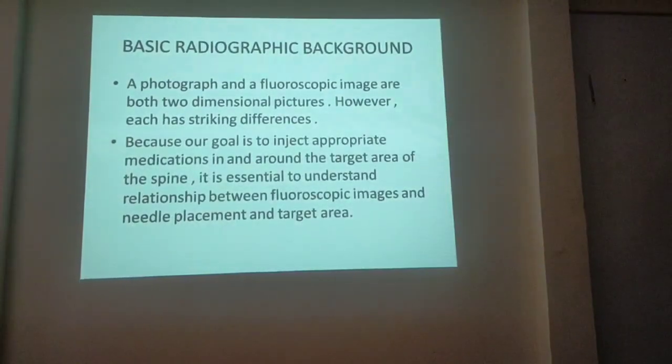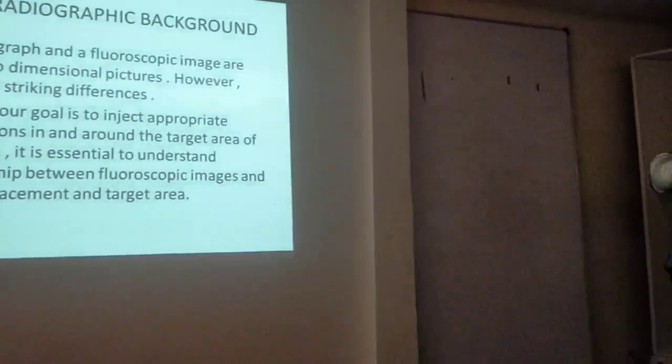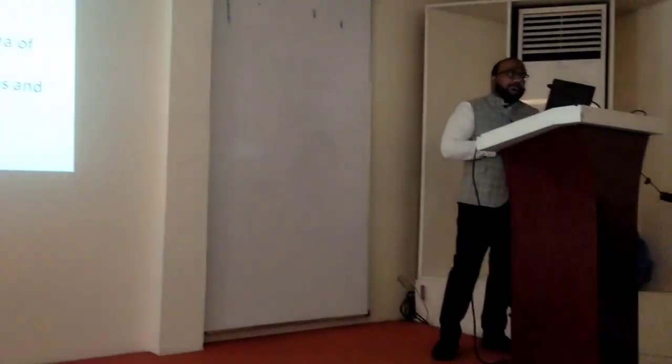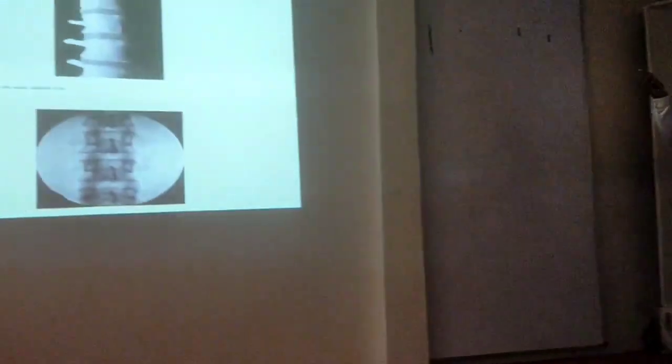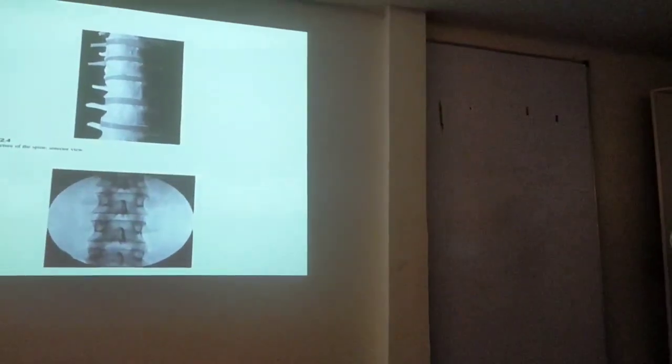What I want to teach you is how to understand a fluoroscopic image from the basics. A photograph and a fluoroscopic image are both two-dimensional pictures. However, both have striking differences. This is a photograph of a model of a lumbar vertebra. This is the fluoroscopic image of the same.